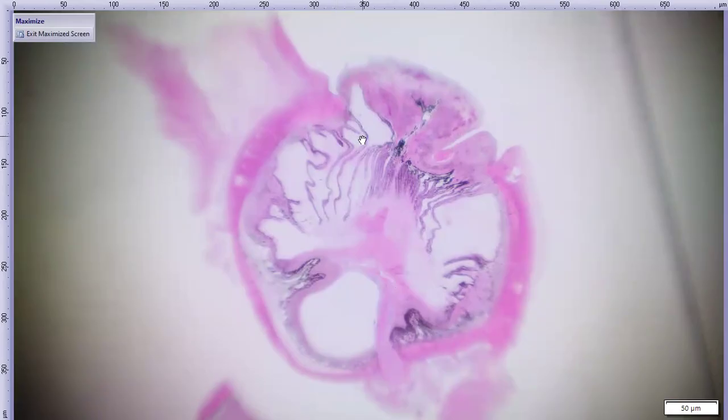All of these lovely little folds here are ciliary body plicae. And essentially, these are coming into the plane of section at odd angles because this is such a small globe. We're likely getting some of the plicae coming in from deeper in the block, which is why it looks like there's a bunch of plicae just filling the posterior chamber and looks a little weird. A bit of a distorted globe.